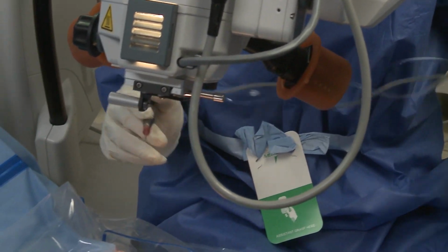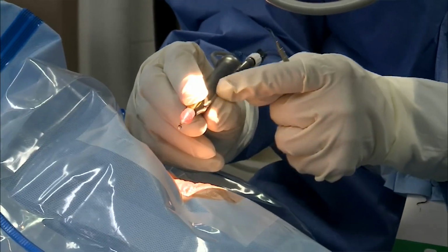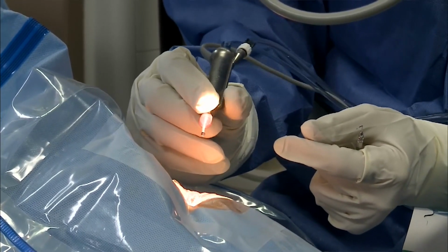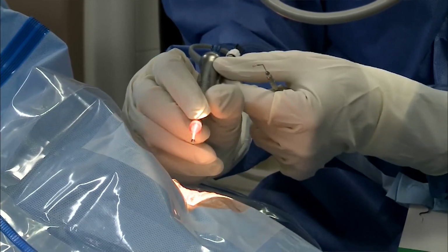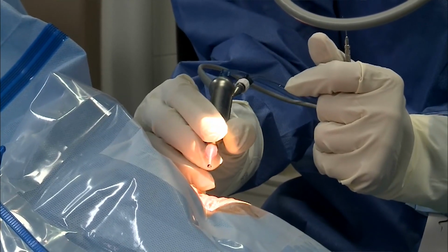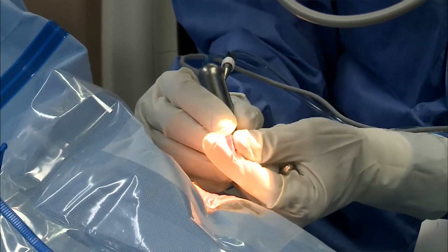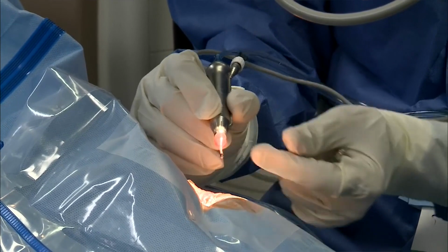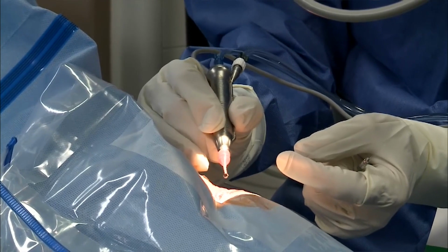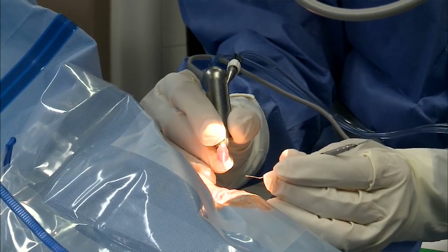I'm obviously a right-handed surgeon. Holding the phaco handpiece, there's an infusion line on the outside. You can use that to put your thumb on, under, or even above if you like. And the nice thing about that is it makes it easier to rotate the instrument. The second thing is to hold instruments short. The longer you hold them, the less control you have on the tip, and a little motion, the tip moves more than if you hold it short. Okay? Same thing with the second instrument.